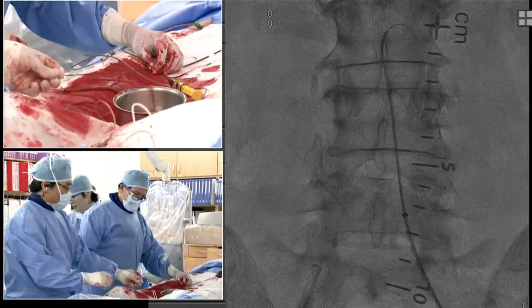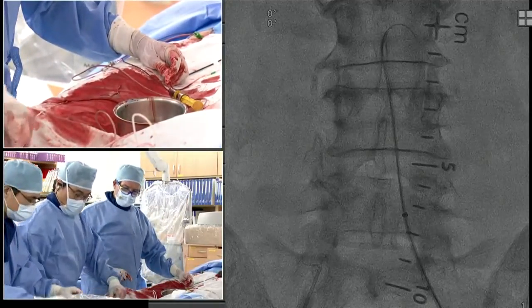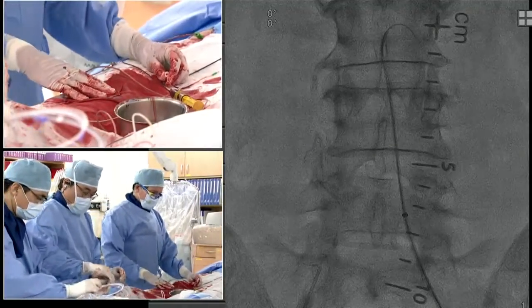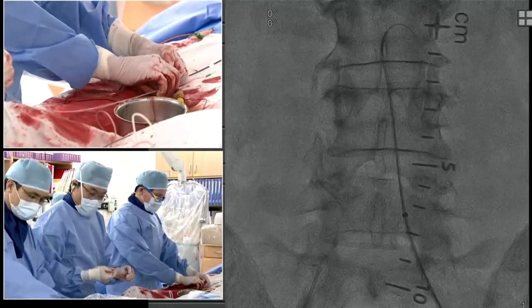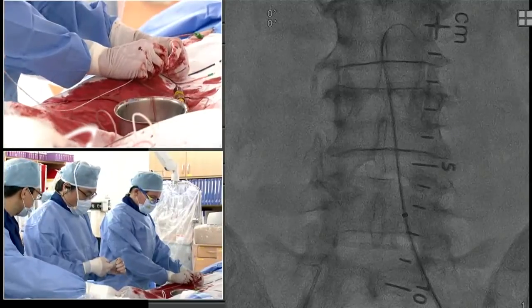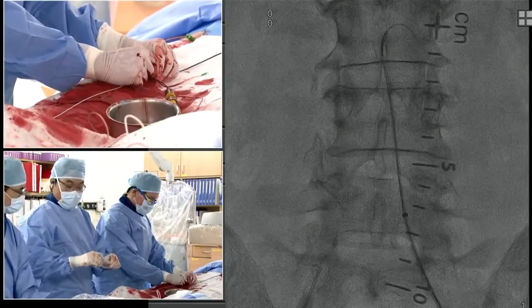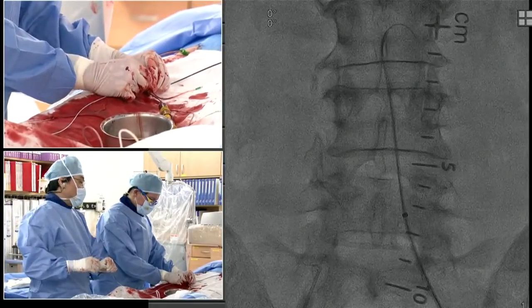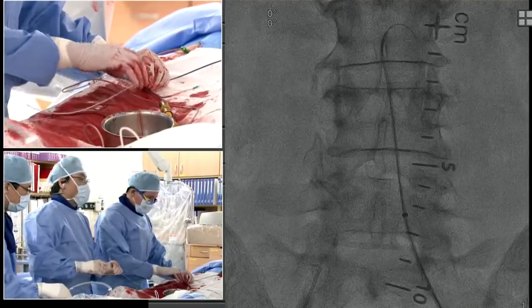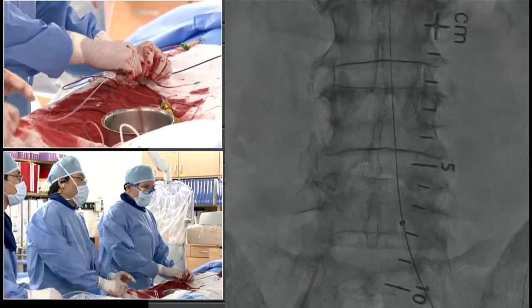So any last comments from the panel here? What would you do next with this case? If I was hell-bent on coming from above, I would flip over to a brachial approach and just use a multi-purpose. If I thought that we could do the finger of God and connect the two dots, the retrograde technique I think is reasonable, and it's probably a shorter distance, so I don't have a problem with that approach. But I think I'd bail on the contralateral approach at this point. Yeah, I think it's either get a better support catheter or just do a retrograde with a reentry catheter for me.